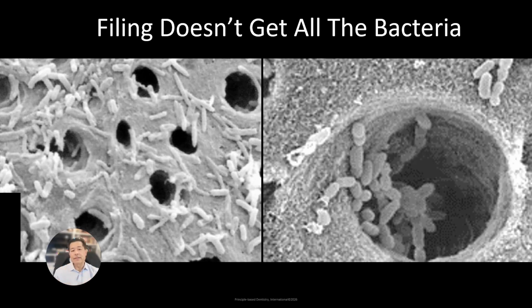It's like putting our phosphoric acid down on a tooth surface before we put our adhesive in our composite. We're going to open those tubules up, and then we're going to go back in with the sodium hypochlorite because now the sodium hypochlorite can get into those tubules that were previously obscured. So it's like placing your phosphoric acid to remove the smear layer, kind of the same stuff, right? It's dentin remnants, tooth remnants, and we're going to remove that, and then we're going to open up the tubules, and into those tubules, our adhesive can now penetrate down in there to give us our micromechanical retention. So in this case, for the root canal, we're using the sodium hypochlorite to dissolve the tissue and disinfect.